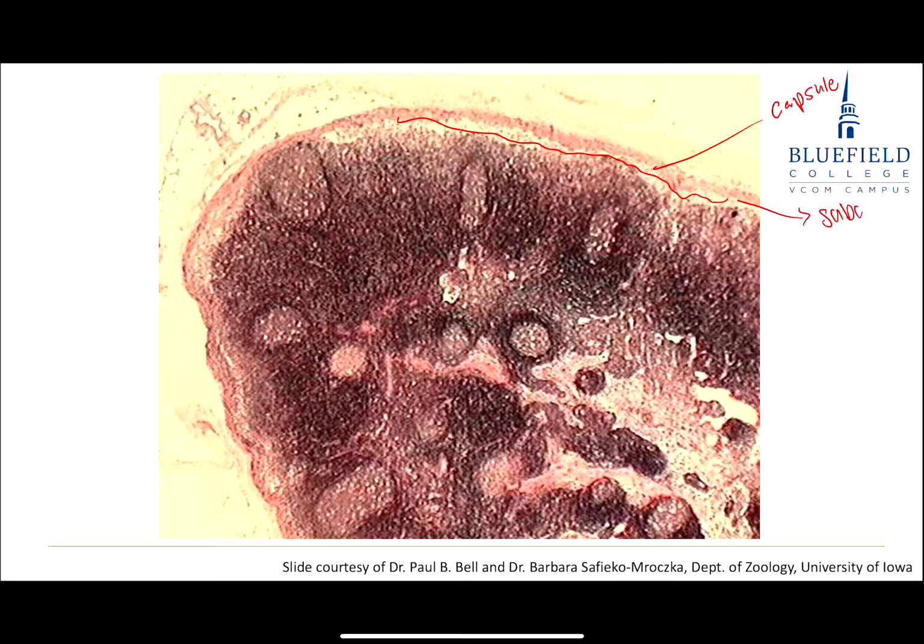Then I look and say, gee, I've got all my lymphatic nodules here in my cortex. Here's my lighter staining inner medulla. It's got medullary cords to it. The majority of nodules are just underneath that subcapsular sinus.